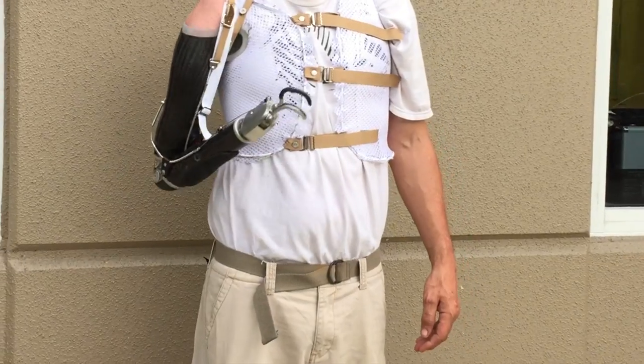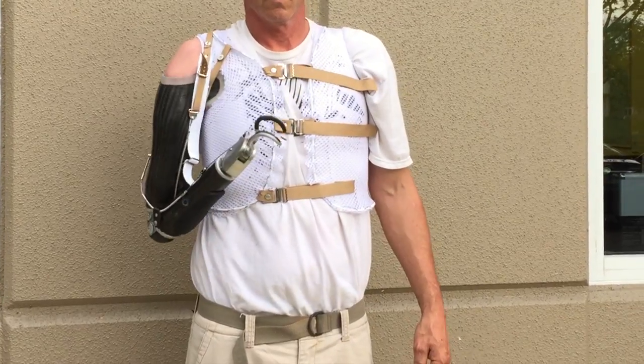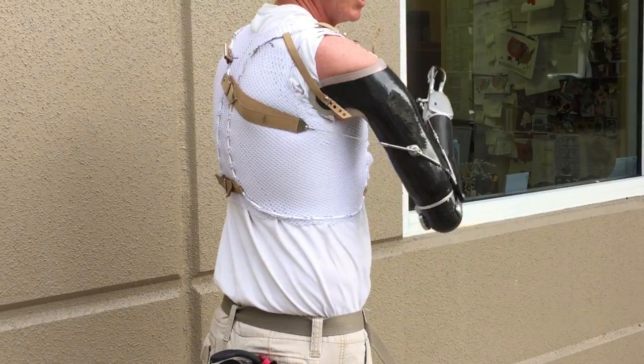The figure 8 vest harness has become a new standard of care for upper extremity figure 8 control and suspension applications. It offers significantly greater comfort, control, and functional outcomes.